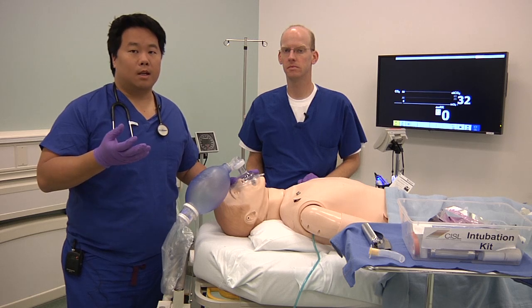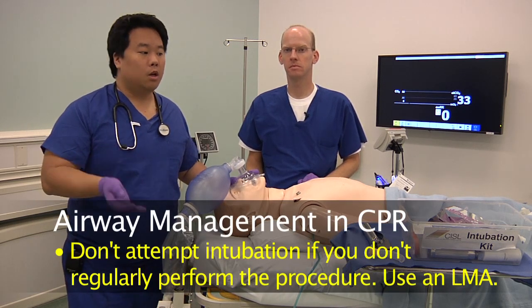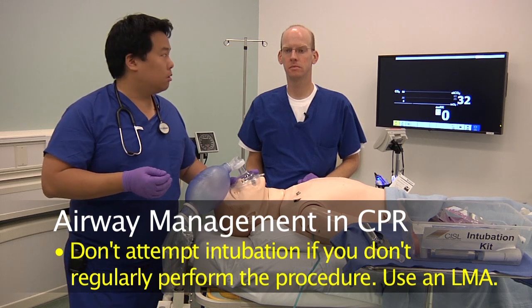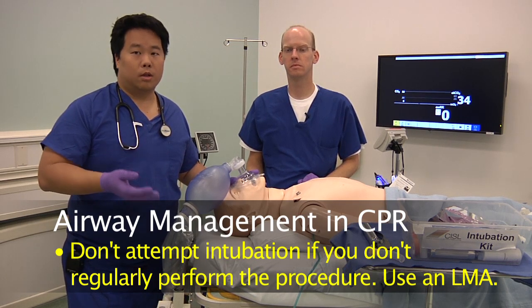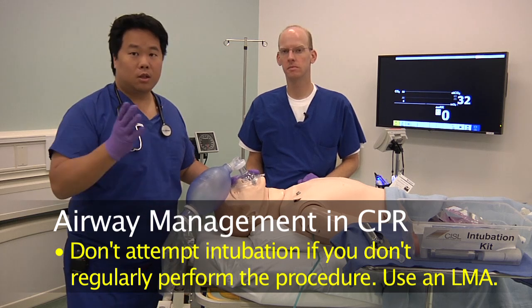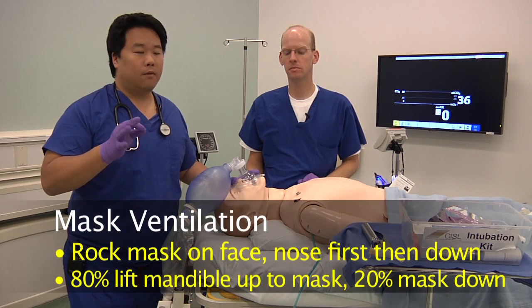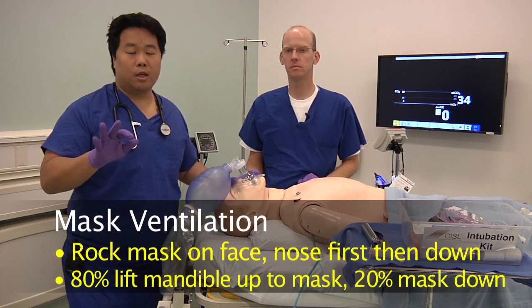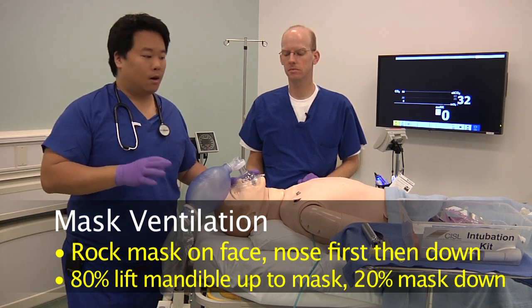Now, I'm not actually going to take you through all the steps of endotracheal intubation because what we know is that if you don't regularly perform endotracheal intubation, you shouldn't be doing it in a code situation. And there are other techniques that you can use, such as laryngeal mask airways, or even mask ventilation. Let's actually talk about mask ventilation. This is a very useful technique that can often give you time and bridge the period between apnea and when you can secure the airway.